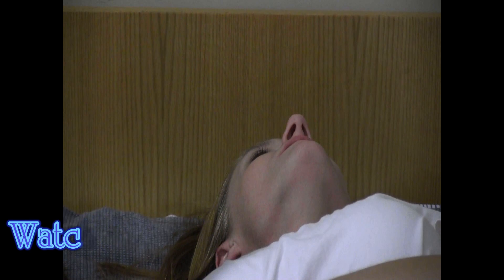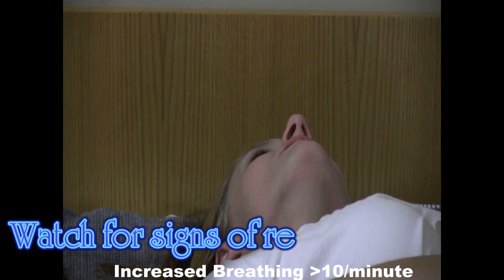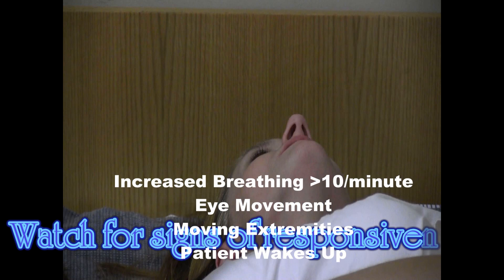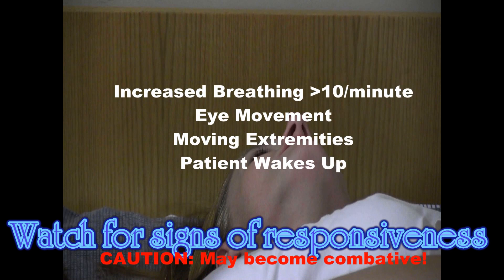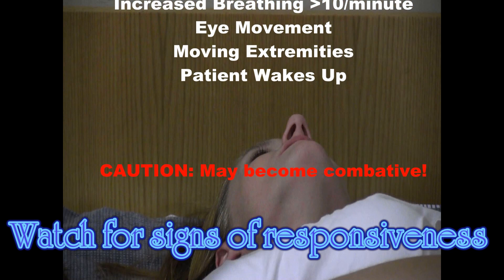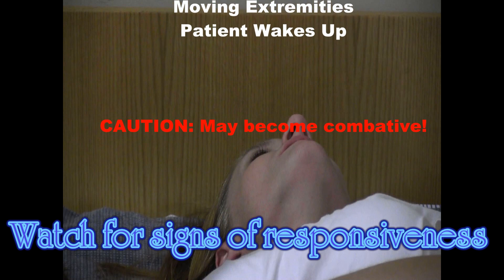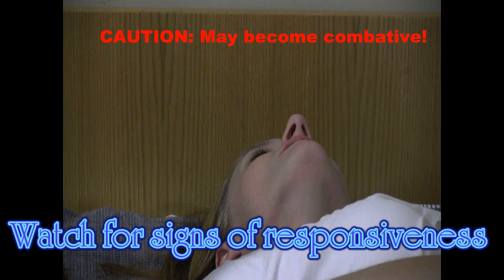Observe the patient for signs of responsiveness. This may include breathing greater than 10 times a minute, eye movement, moving extremities, or the patient waking up. Use caution, as the patient may become combative.